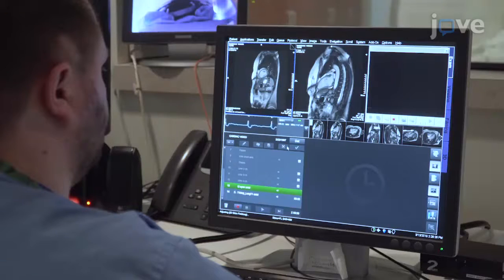Cardiac magnetic resonance, or CMR, is important in the evaluation for potential thrombus because CMR can provide a definitive diagnosis of the etiology of a cardiac mass. CMR has advantages over other modalities such as echocardiography, as CMR can provide multi-sequence detailed characterization of soft tissue masses, where echo offers primarily visualization and size measurements.